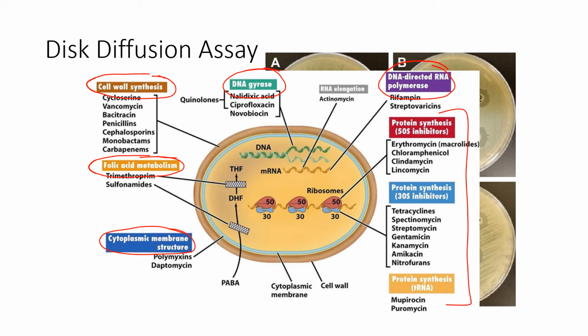For example, these antibiotics that have an effect on cell wall synthesis are usually much more effective on gram-positive bacteria compared to gram-negative bacteria.